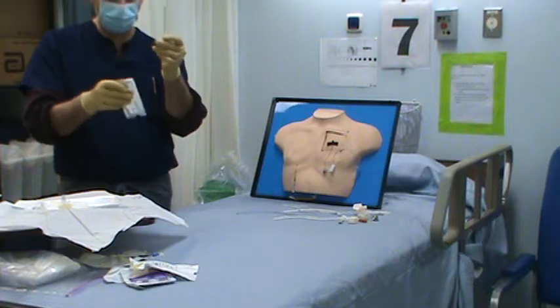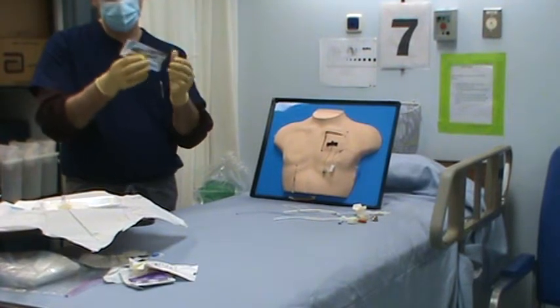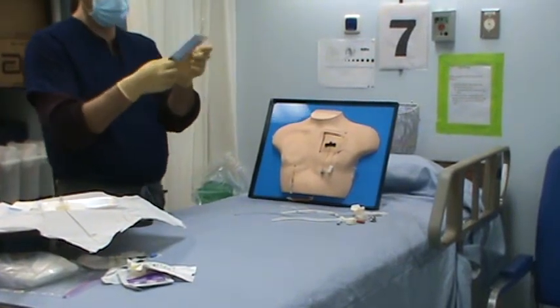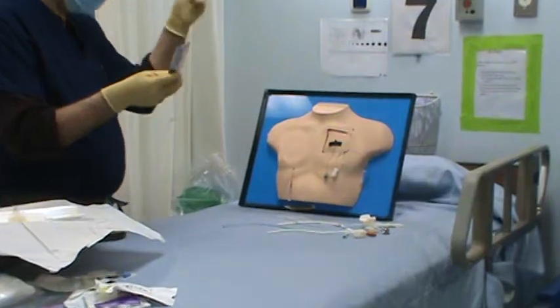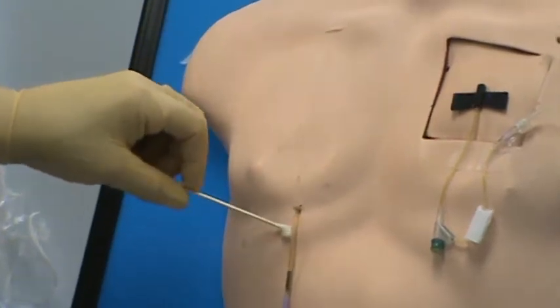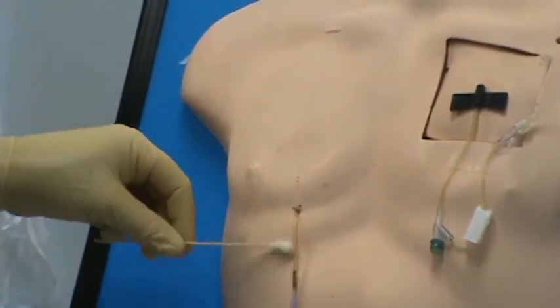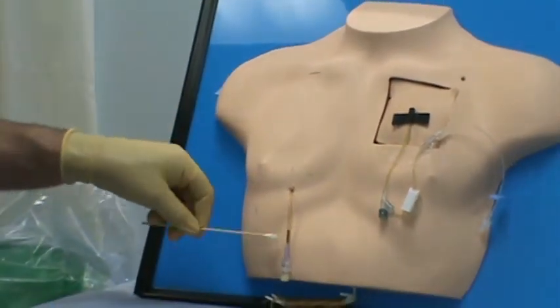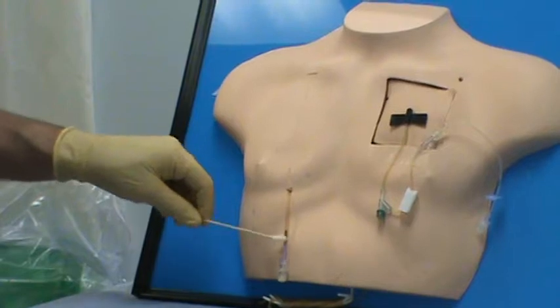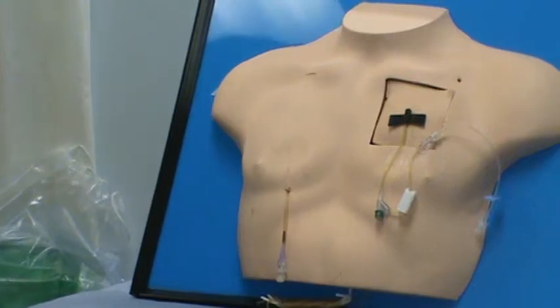Now, if you feel these, they're big cotton tips, almost as big as your fingernail. These little Q-tip things are small, but just know these are a lot bigger. And after you're done with the sim lab, heck, open them up and look at them if you want to. You'll have to let it dry out, but these are big, giant Q-tips compared to these little things. So I got the last one, so I can just throw that away, and I'm going to, once again, do this. It's much easier with that bigger Q-tip. I have to go just down around the end of the hub. Okay, so now I've got all that washed off.